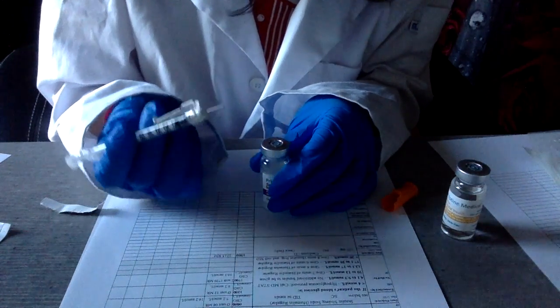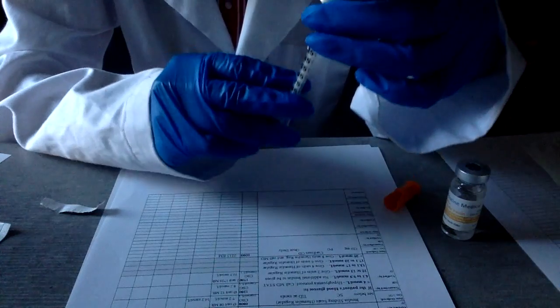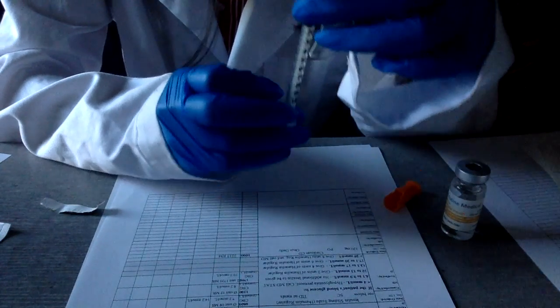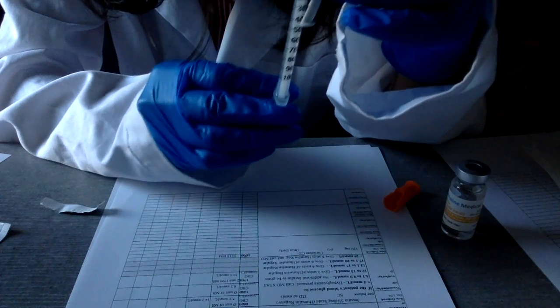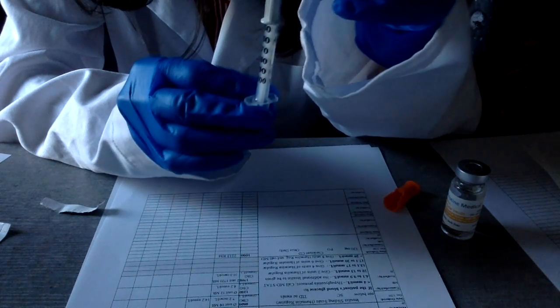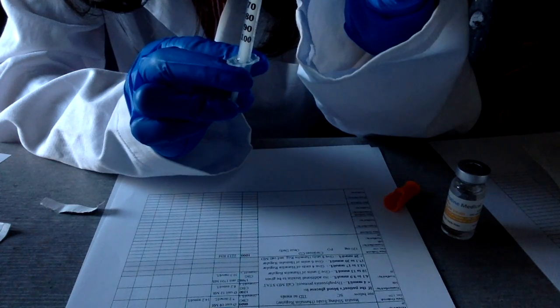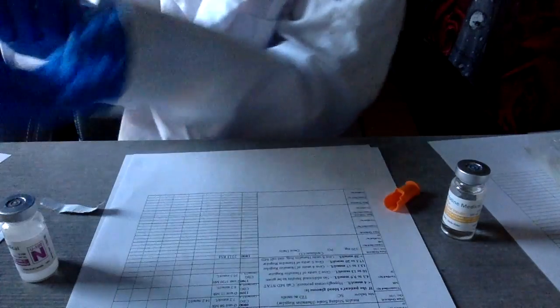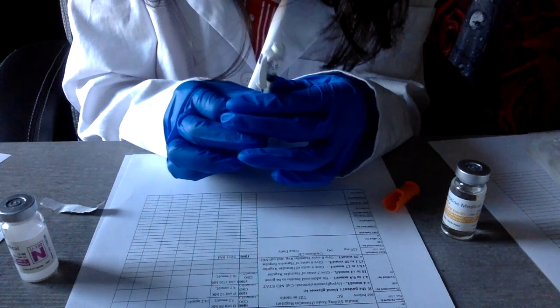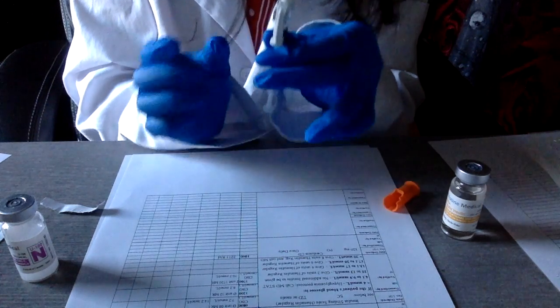Then we'd get our Humulin N, put that in there, flip it over, and we'd draw out a total of 26 units. That's the total amount of insulin that we'd be giving to the patient. So let's go to 26 units. Alright, so we have 26 units. Just making sure there's no air bubbles. No air bubbles.